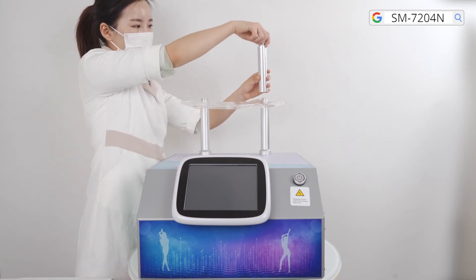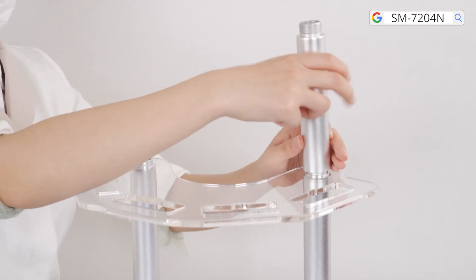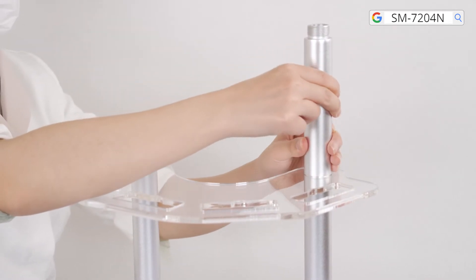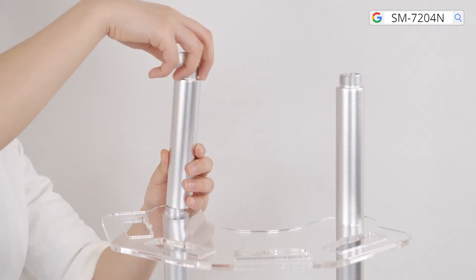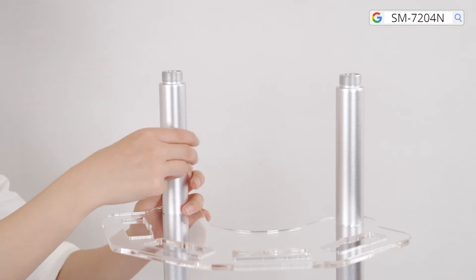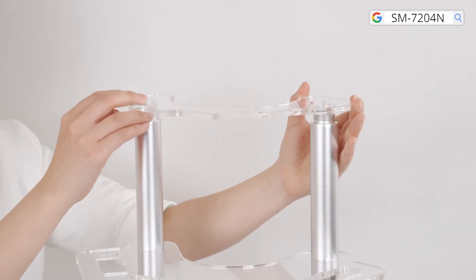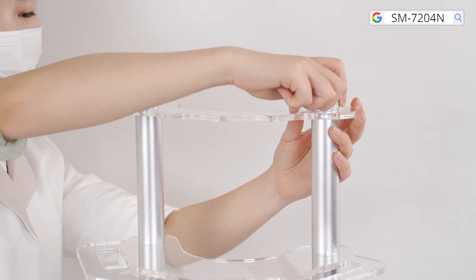Remove the caps of the short supports. Fix the other acrylic holder under the screw thread at the top of the short supports, and finally screw the caps tight.